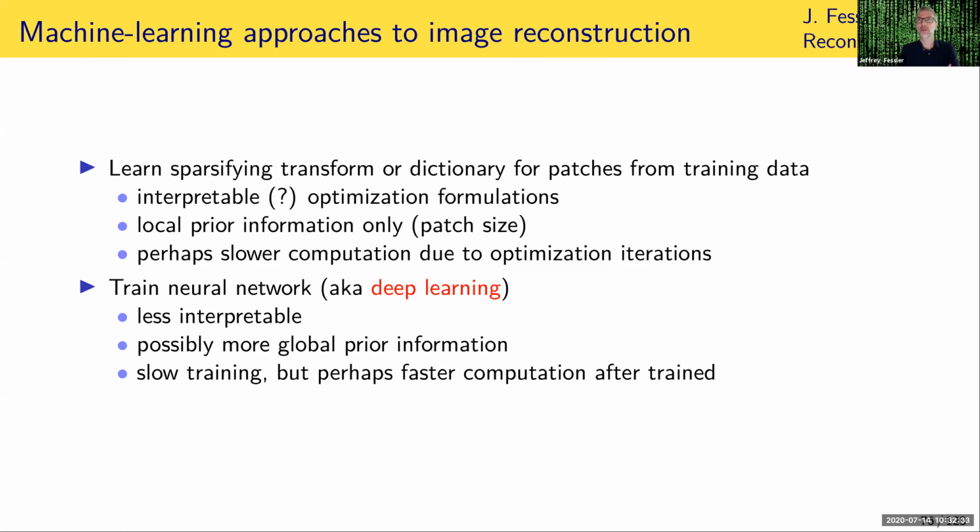They have both the pro and the con that if you use 8x8 patches, you're only able to exploit redundancy or dimensionality reduction of those patches. I think that prevents you from hallucinating any big structures, and we'll talk about that more a little later, but it also maybe limits how well you can do.